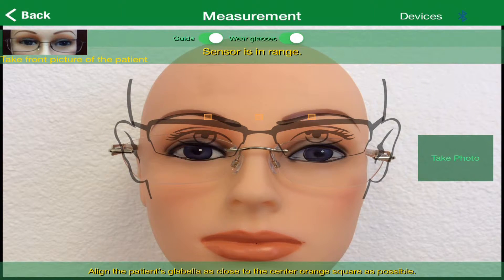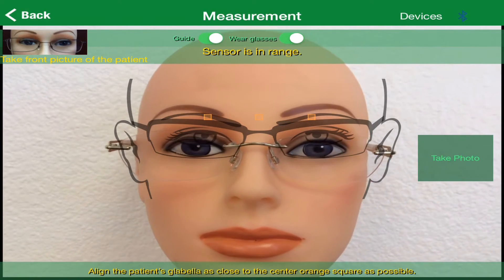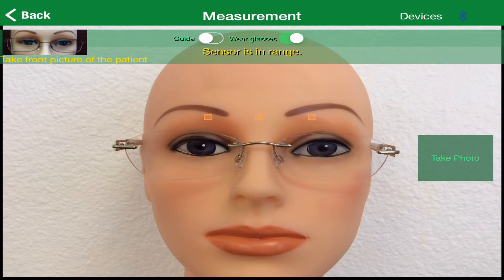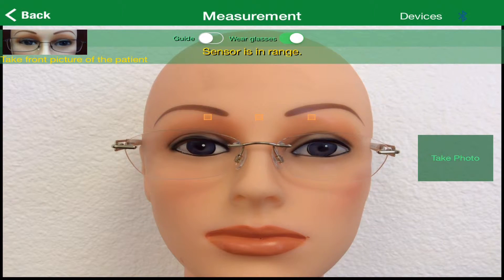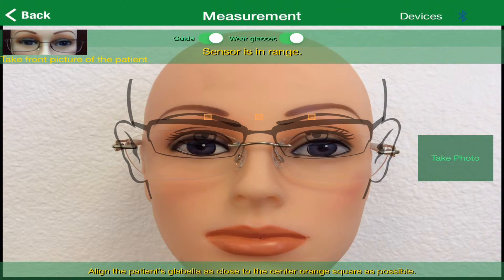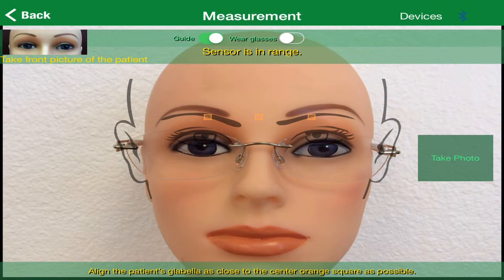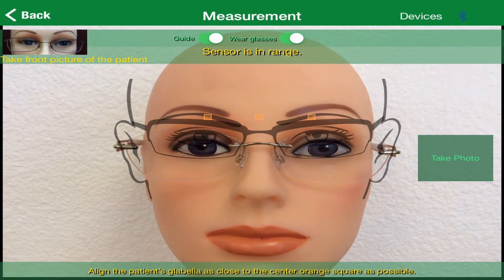Near the top of the screen, under the word Measurement, you'll notice the words Guide and Wear Glasses, along with a slide bar that consists of a green slide and a white dot. If you slide the white dot next to the word Guide, you'll notice that the on-screen guide showing a transparent model wearing glasses, and the guide at the bottom, appear and disappear. Using the model guide is optional, but is very helpful in helping you determine the best distance from which to take your patient's measurements.